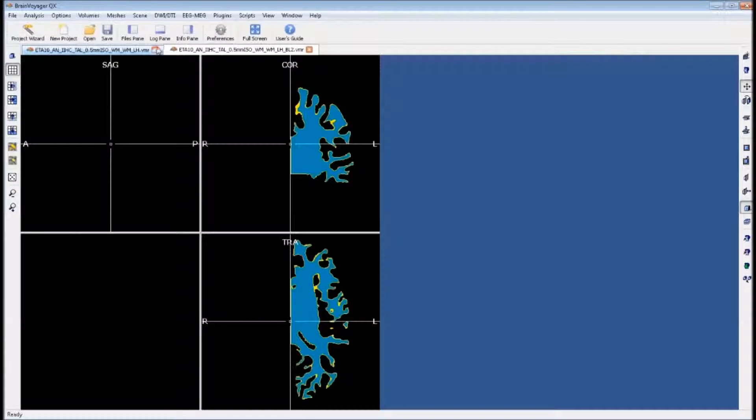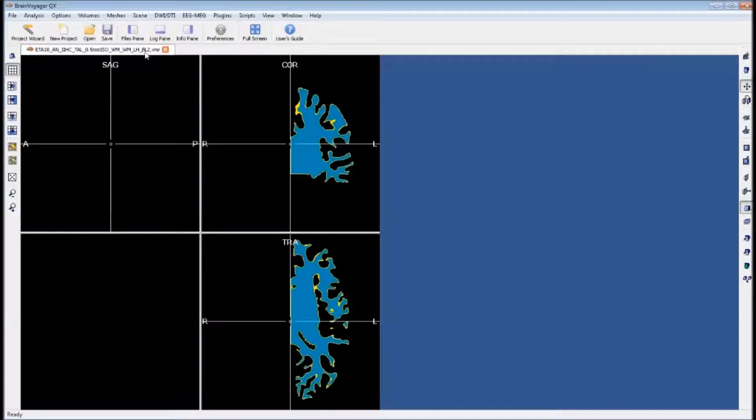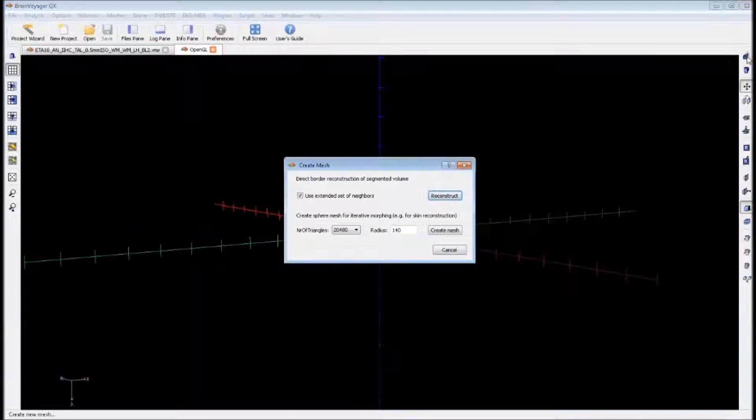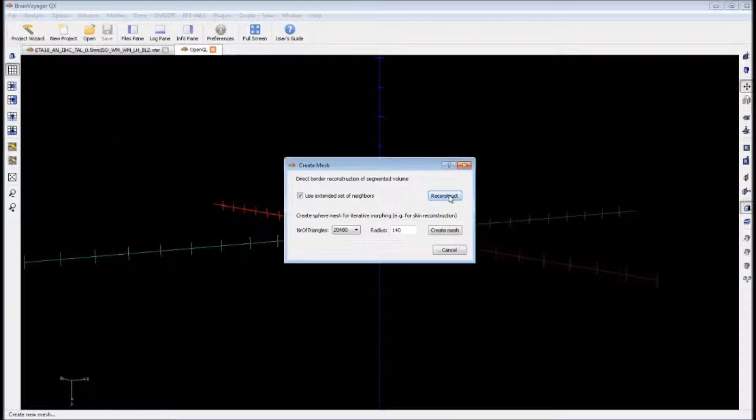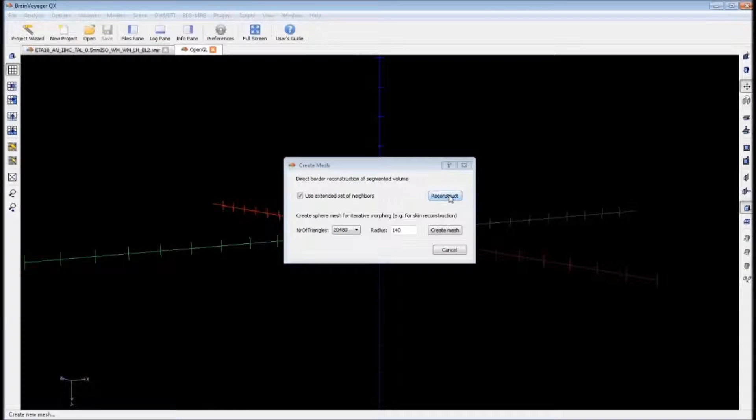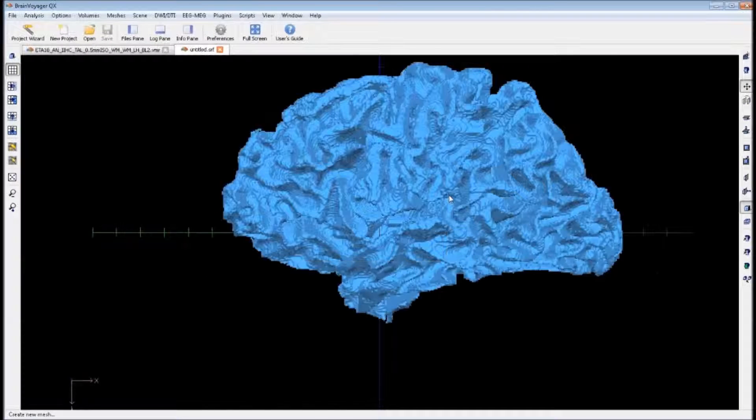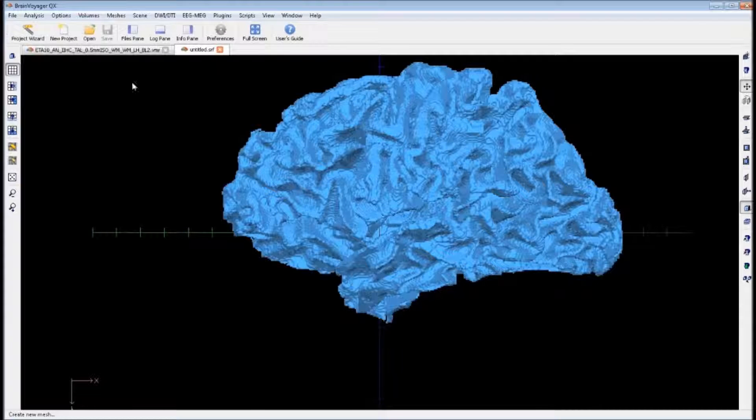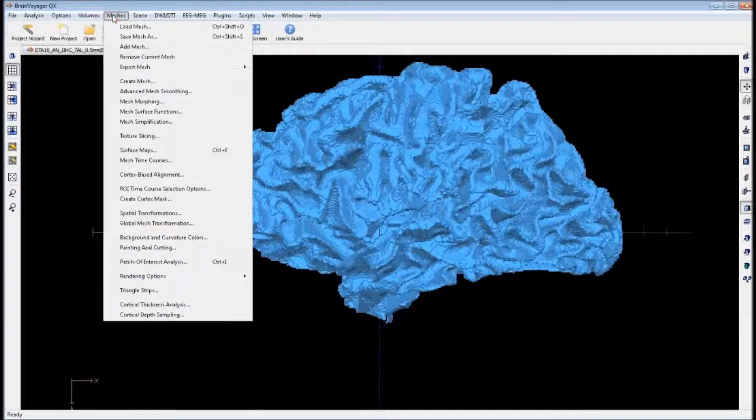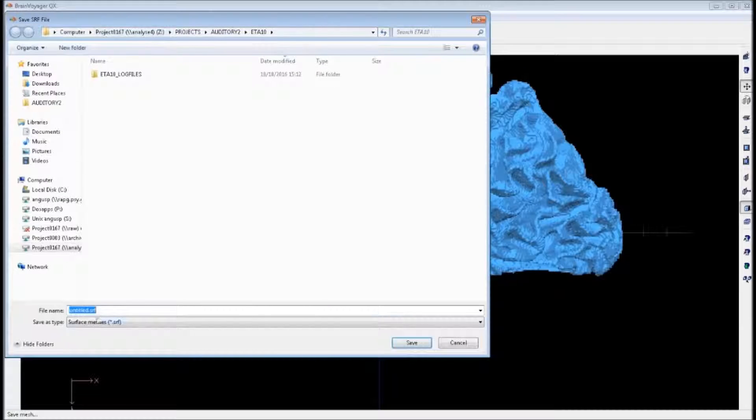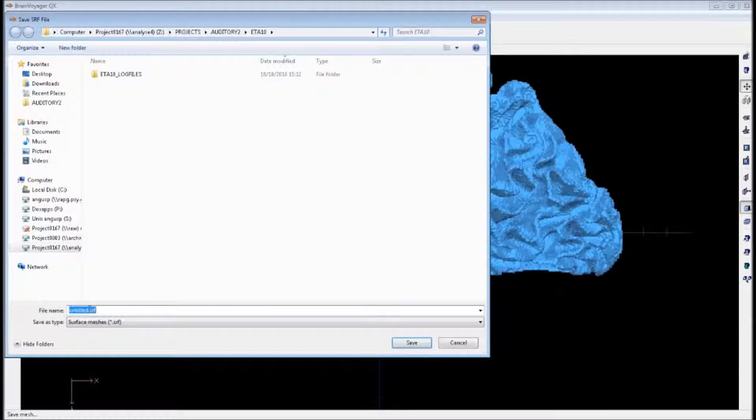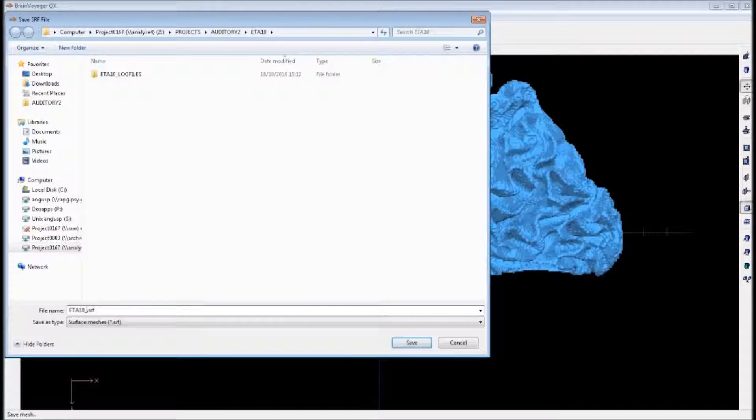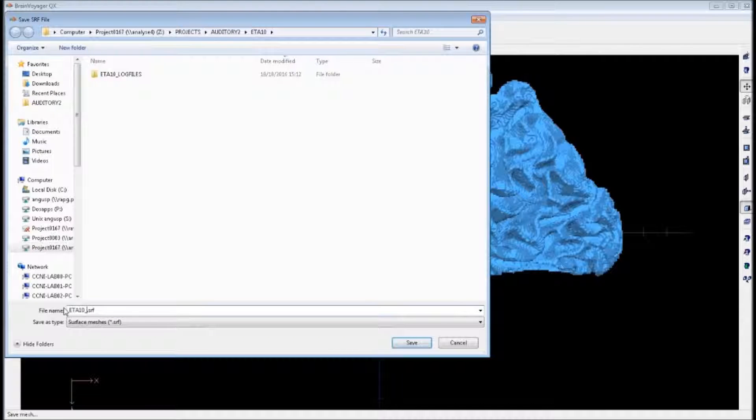Now we want to save the new file so that these values are saved. We can close the original, hold in shift and click the top right button in BrainVoyager. This will open up this create mesh window and we can reconstruct this left hemisphere mesh. You'll get something like this. This mesh we want to then save. Typically, we'll save it with the subject ID, which hemisphere it is, and the extension underscore recall for reconstruction.